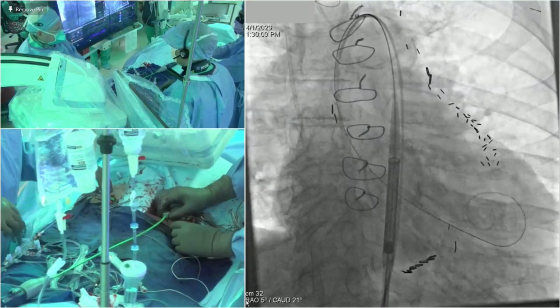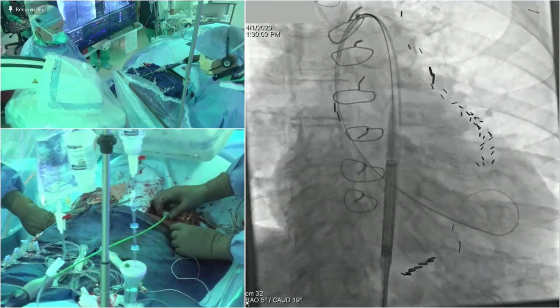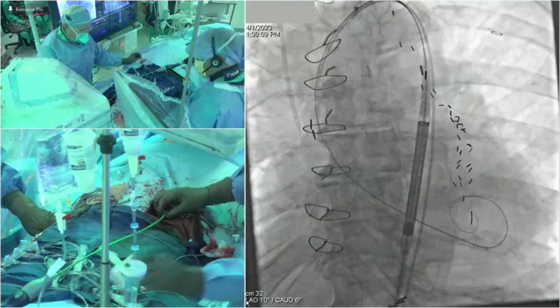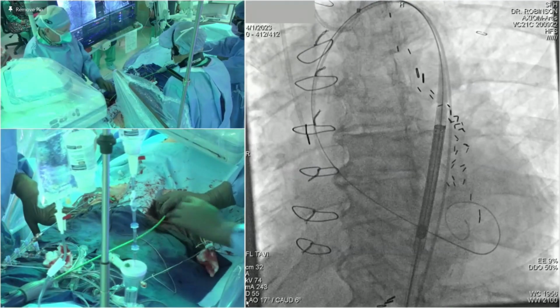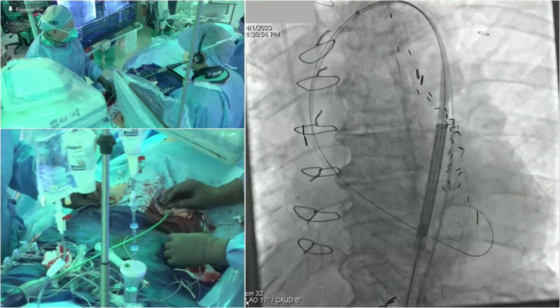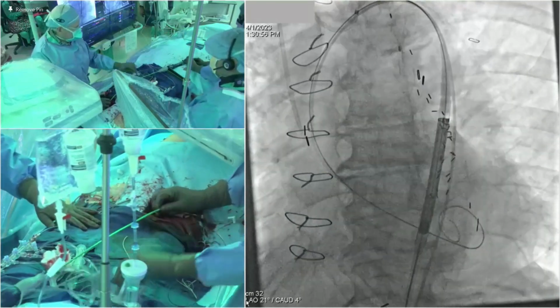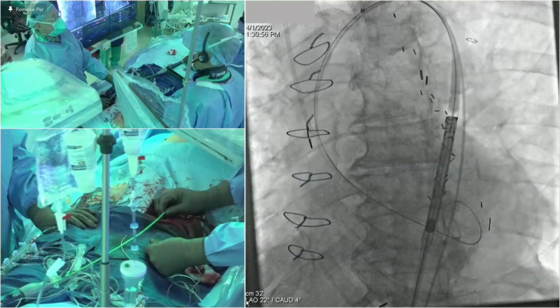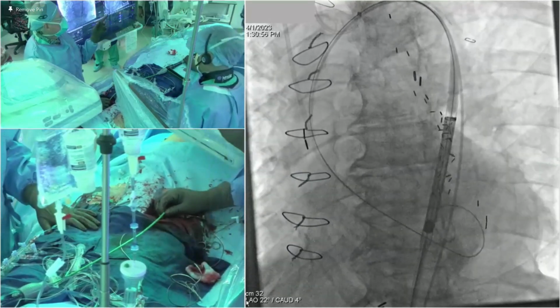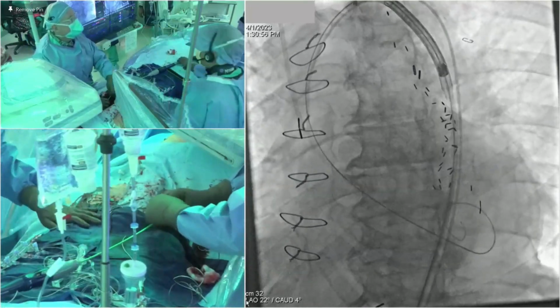Okay. All right. Good. Do you want to go LAO? You want to test pacing? Sure. To test that, we need the wire fully sheathed. One of the things with Evolut valve implantation is that we try and aim for commissural alignment. So in LAO, I want the hat marker to the outer side, and that corresponds with a 3 o'clock position of this hub right here at the back.